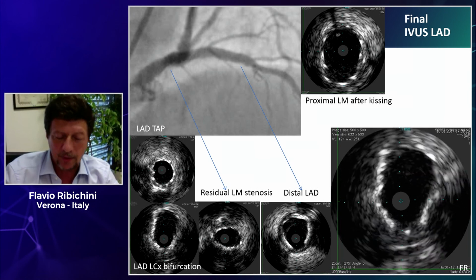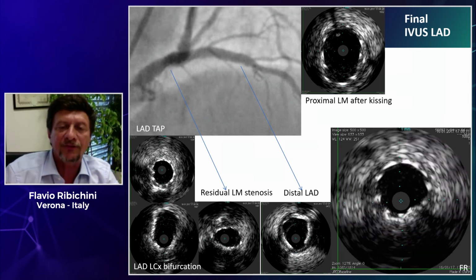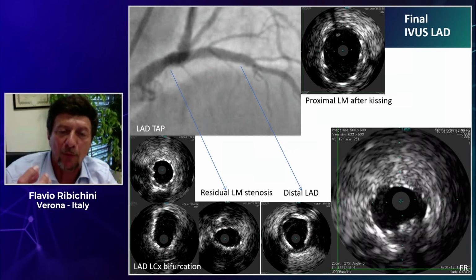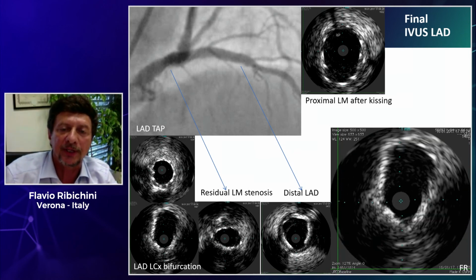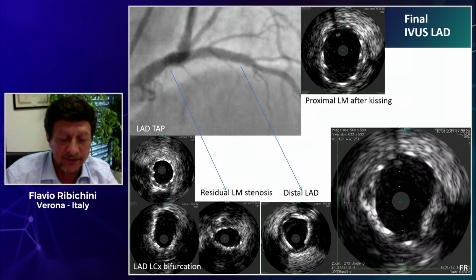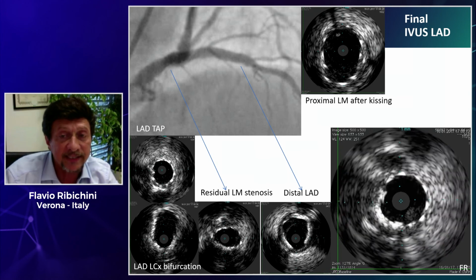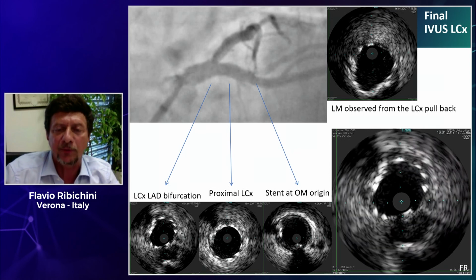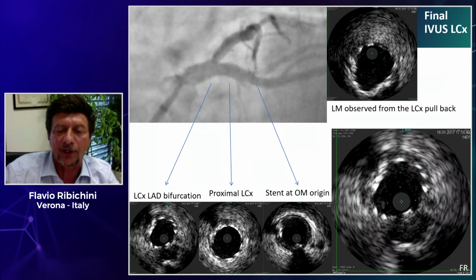We have a very wide area of the left main, although it's clear that there is still a mass of rock protruding in this left main bifurcation. As Margaret said, it's a very delicate point. And when we do the IVUS from the left, we confirm a really very big circumflex.